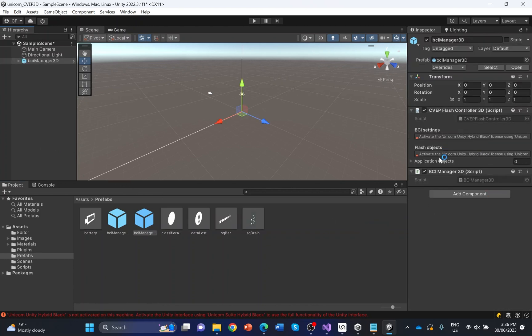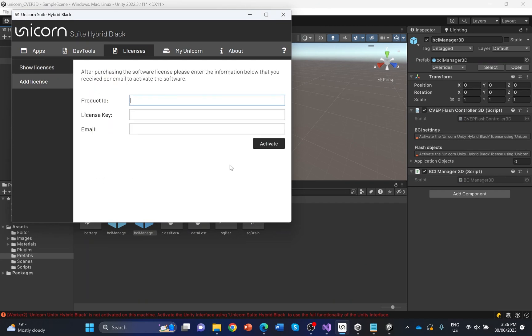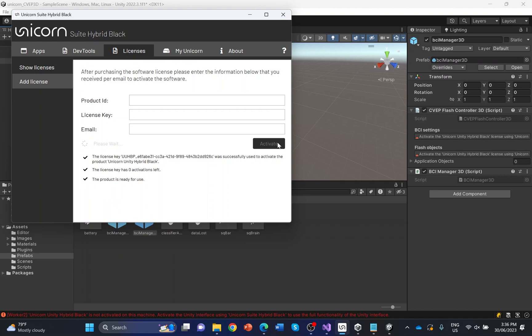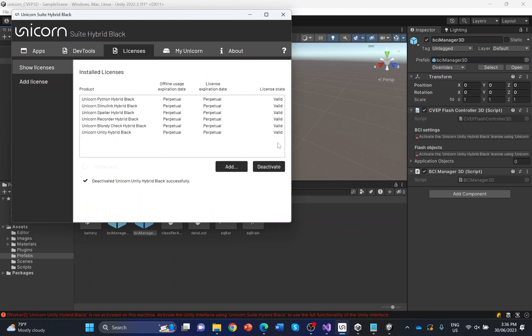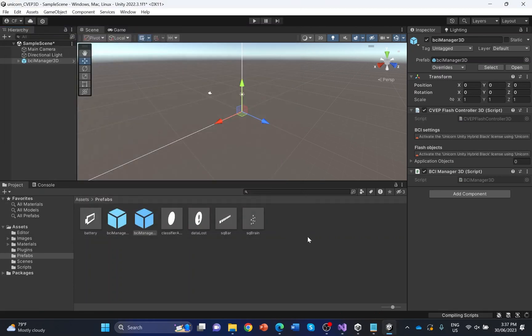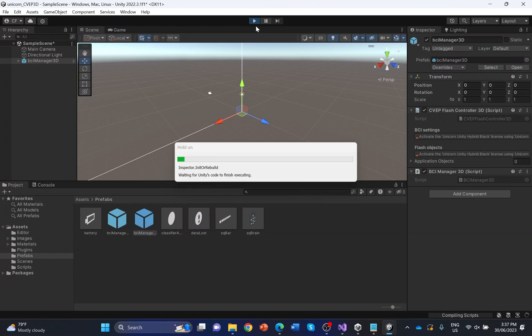If you look at the Inspector dialog on the right side, you can see that the license key has not been activated yet. Open the Unicorn Suite Hybrid Black and go to the Licenses tab. Click Add to activate a license key. Enter the license information received via email after purchasing the Unicorn Unity interface from the web shop. The Unicorn Unity Hybrid Black license should be listed as Installed License now. Close the Unicorn Suite. The license activation has not been updated in Unity yet, so update the license by clicking the Play button. The license warning should disappear now.